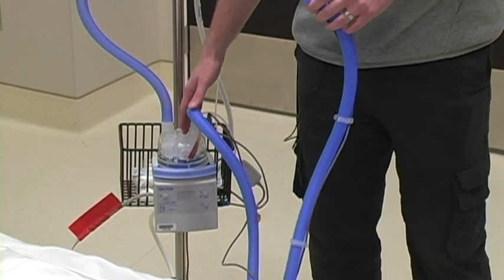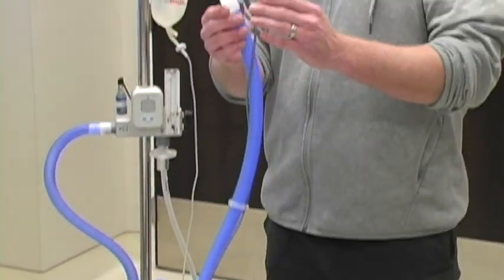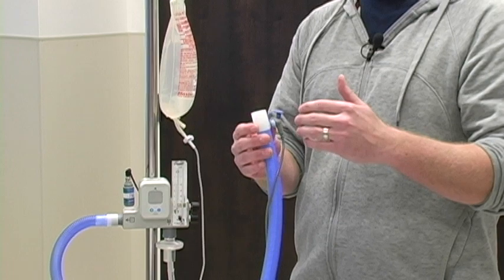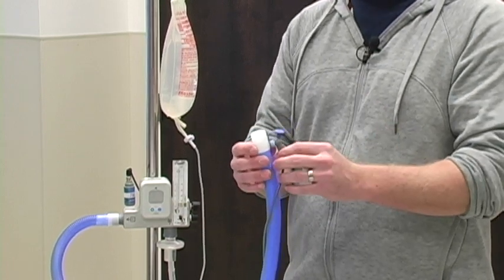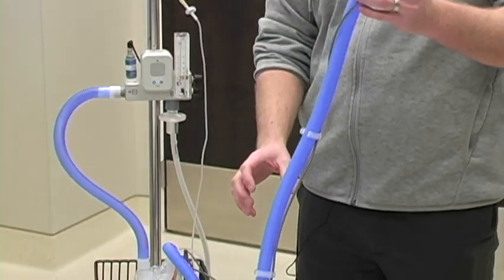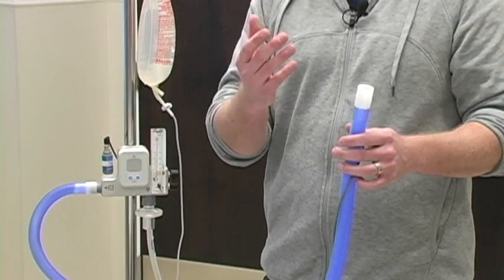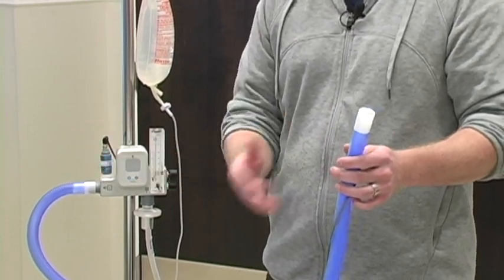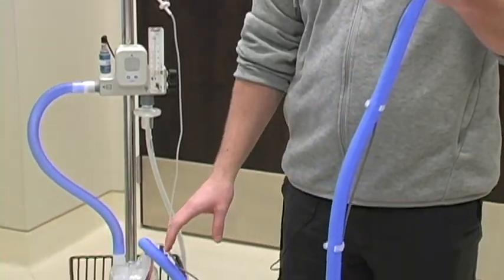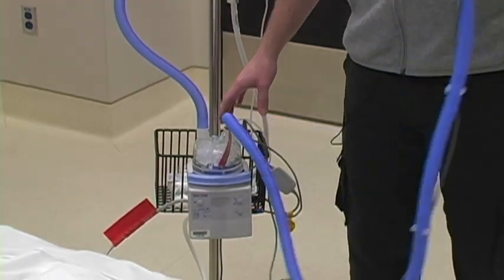So once the gas is heated and humidified to the appropriate temperature, it'll go out this other hose up towards the patient, and then there's another temperature probe at the end of the hose, just to make sure that the temperature of the gas is consistent to the patient. This also has a wire in there, so it really gets rid of that condensation that tends to build up in our high flow aerosol setups. You guys have probably always heard that sloshing water back and forth and you have to drain it and that kind of thing. With this circuit, that shouldn't build up. If it does though, just tilt it up and the water will go back into the chamber, so that's fine.